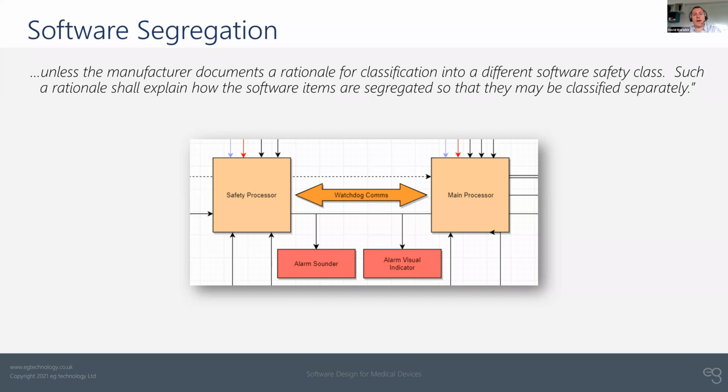And the benefit there is that the changes that you are more likely to want to make as your product matures can be centered around the user experience, the user display, things that are actually non-critical aspects of performance. And that allows you to make updates to the main part of the system, the user experience of the system, without touching those really critical aspects which are separated off.